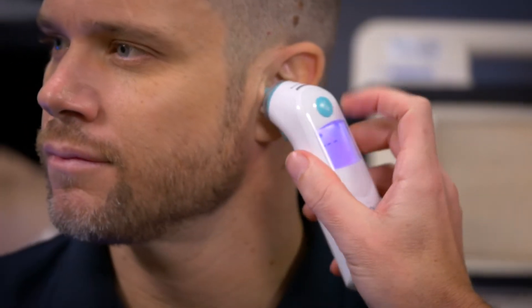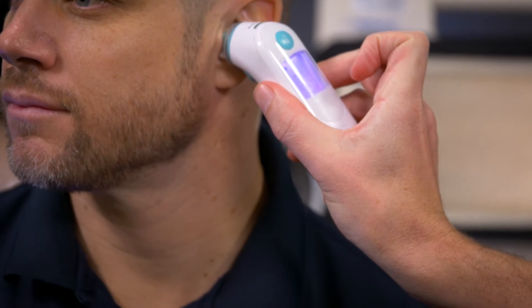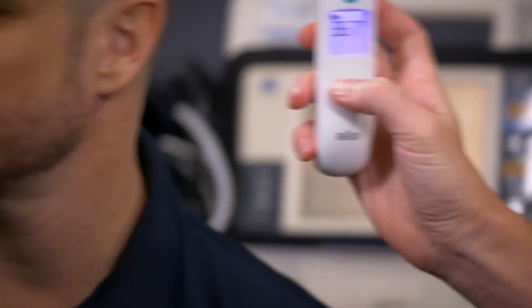We pop it in Ben's ear, press the temp button, and just wait for the beep. 36.7.